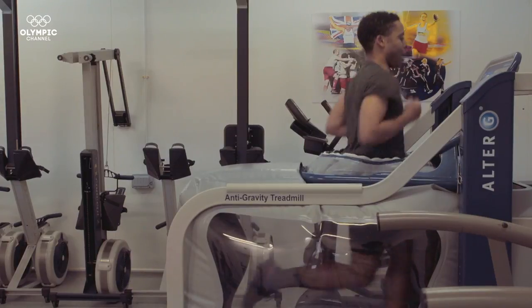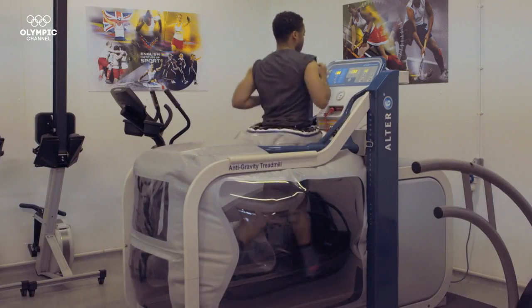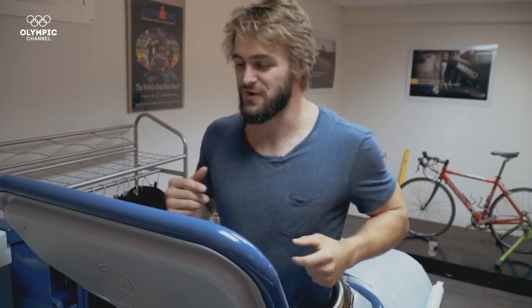Training at only 20% of your body weight is now possible. This anti-gravity treadmill heavily reduces recovery time and pain after experiencing an injury. It's like running on the moon.